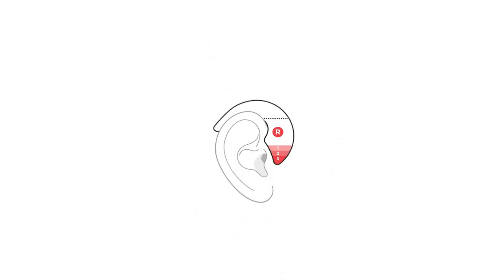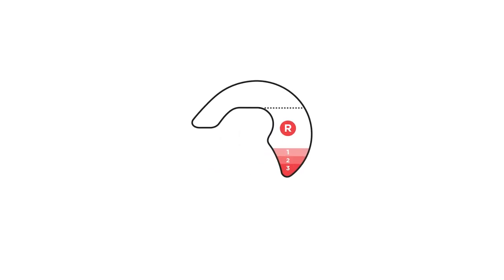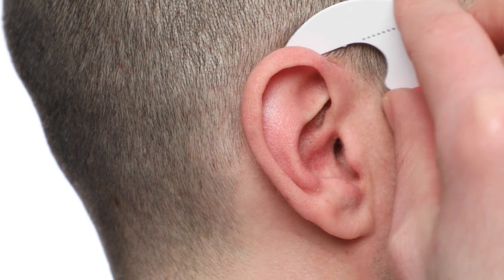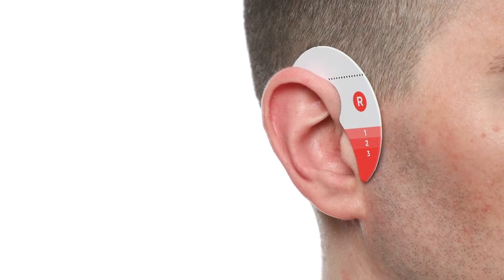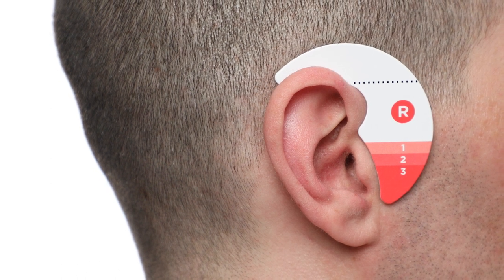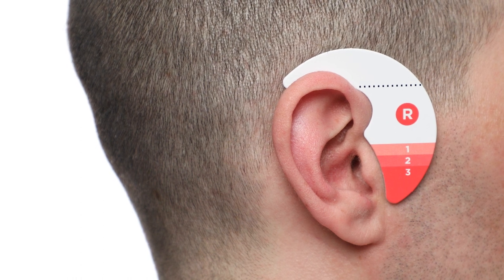To find out which hearing aid cable size is the correct fit for you, use the cable sizing tool provided in the box. Use the red side to measure your right ear and the blue side to measure your left ear. The sizing tool should hook around the front of your ear and lie flat against the side of your head. Make sure that the dotted line near the top of the tool is aligned with the top of your ear and level with the floor as you look straight ahead.